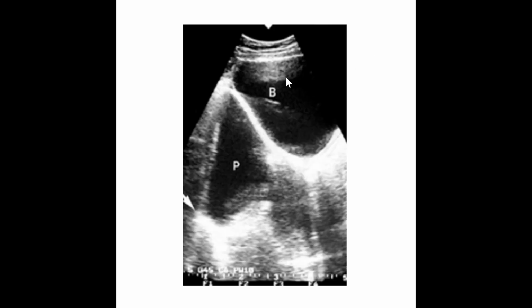So here we have an example of a multipath artifact occurring with the bladder. Now the sound comes in, bounces off the strong reflection of the posterior wall, maybe sent over to this wall, maybe bounced up to this wall, and then eventually made it back to the transducer. So the sound just kind of bounced all around the bladder before returning to the transducer. The transducer, thinking, well, I sent a beam this way, thinks whatever echoes returned along that path should be mapped to this area. And so what we see is kind of a similar appearing bladder, not quite an exact replica, but it's still deep to the true anatomy with a similar appearance.